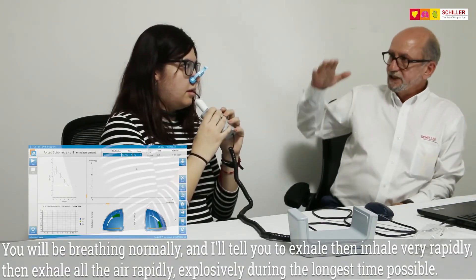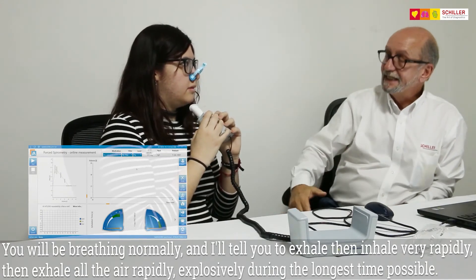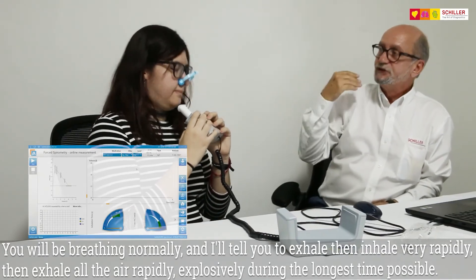You will be breathing normally until I tell you to exhale, then inhale very rapidly and then exhale all the air very rapidly, explosively, during the longest time possible.